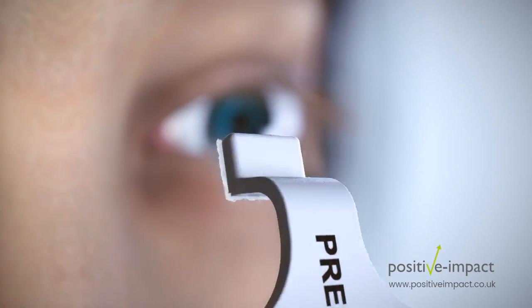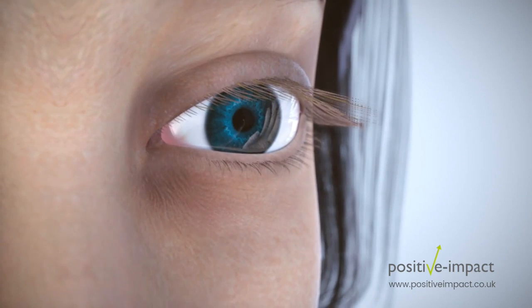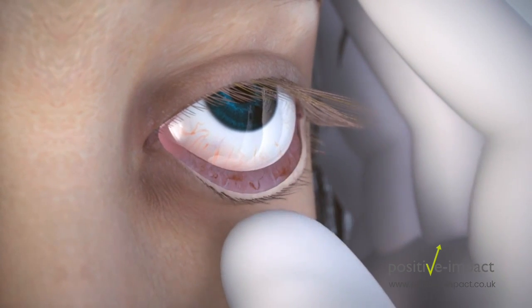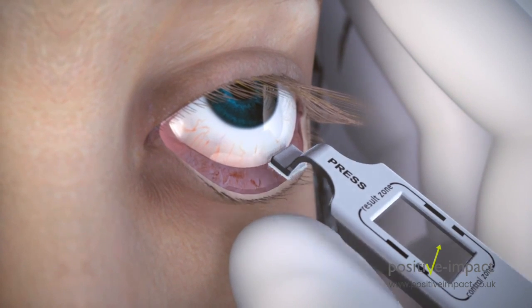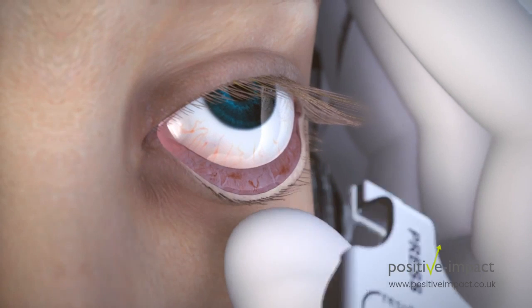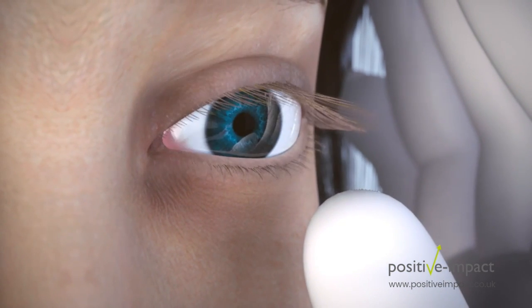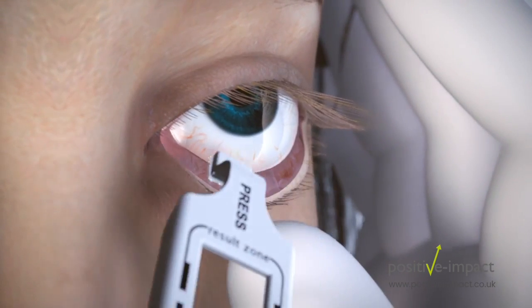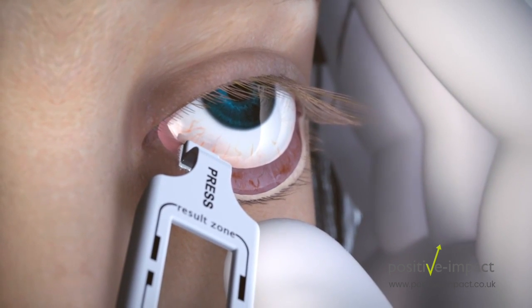Locate the sampling fleece on the underside of the sample collector. Instruct the patient to look up and gently lower the eyelid to expose the palpebral conjunctiva. To collect the tear sample, dab the sampling fleece in multiple locations along the conjunctiva, releasing the lid after every 2 to 3 dabs to allow the patient to blink. After completing a minimum of 6 to 8 dabs along the conjunctiva, allow the sampling fleece to rest on the conjunctiva an additional 5 seconds to ensure saturation.